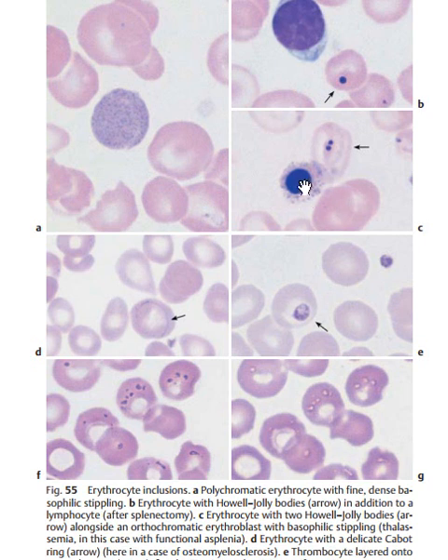This one is an orthochromatic erythroblast with basophilic stippling. So this is seen now in thalassemia. Is it clear? So when you see an orthochromatic cell, you need to know why. Because hemoglobin is not easily produced in thalassemia. You need to know that thalassemia is an abnormality of hemoglobin production, so the cells want to stay in a basophilic stage. That's why the cell type is going to be an orthochromatic erythroblast with some basophilic stippling inside.